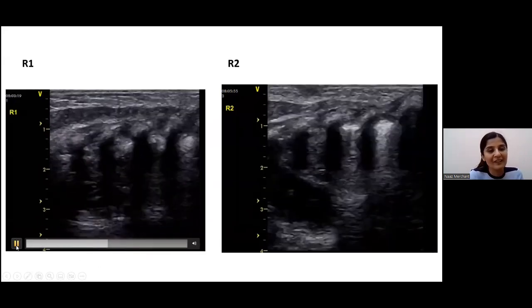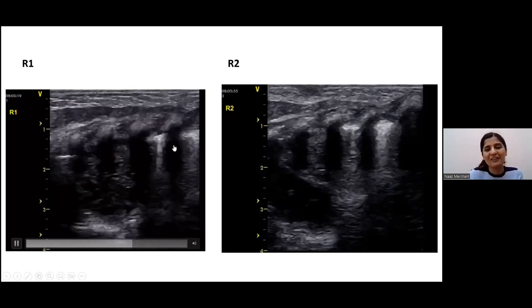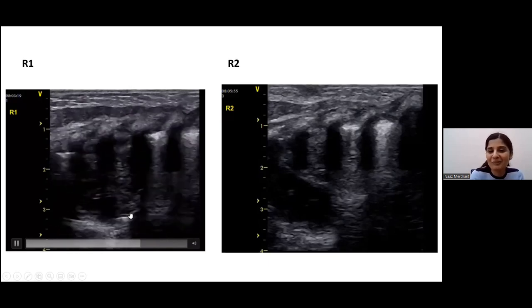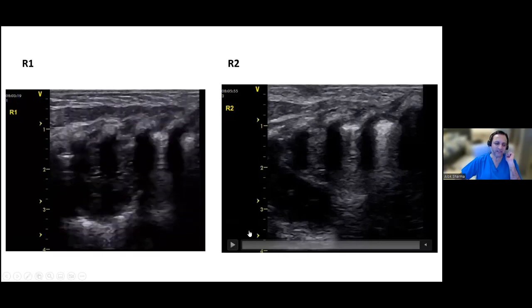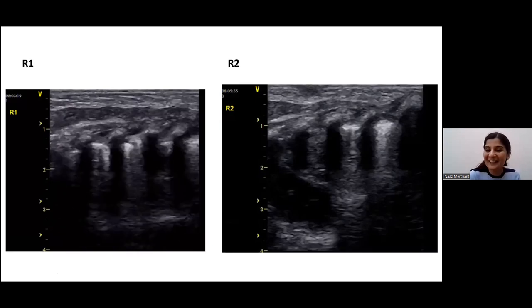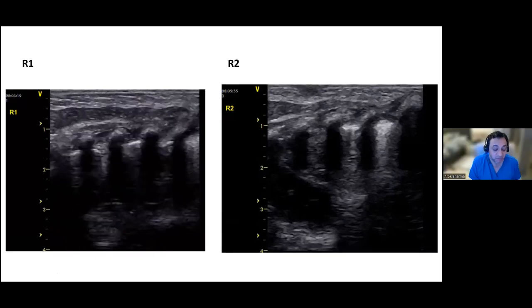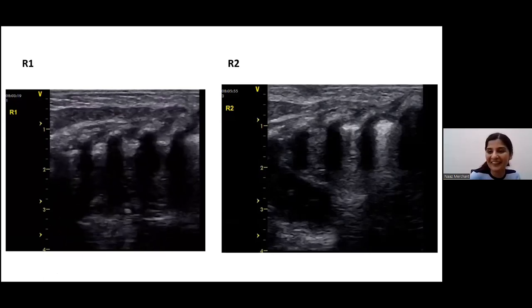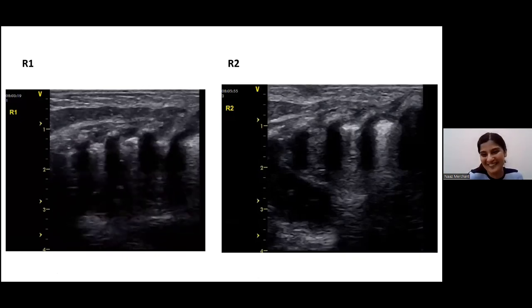On the right side, this was more tricky and more difficult. You do see a bit of lung sliding, but actually the heart was coming in. Do you have a dextrocardia? Yeah, you have a dextrocardia. That's the first thing that came to mind, whether you have a dextrocardia, because you've got a heart that's coming in R1 and that's interfering with your image. So, well, that's a great pickup on the ultrasound. Yeah, it was an interesting pickup on a lung ultrasound.